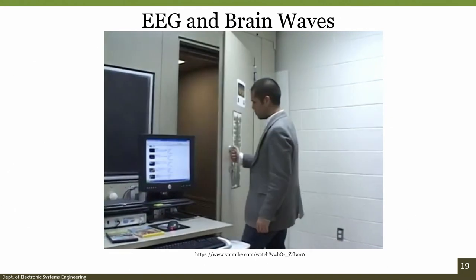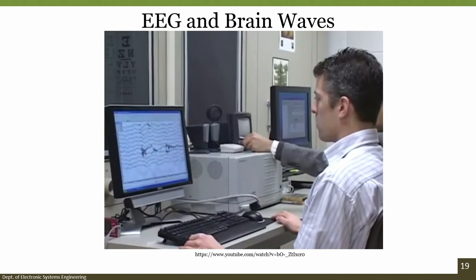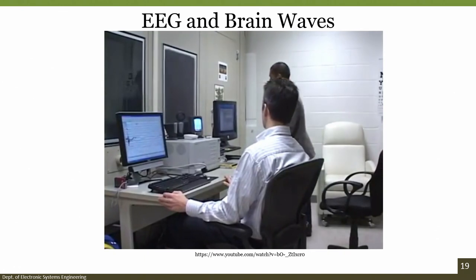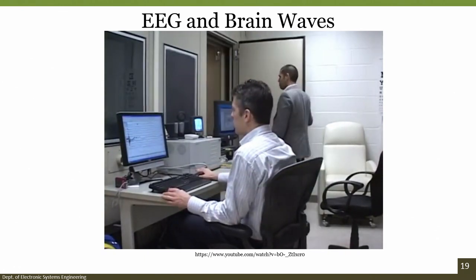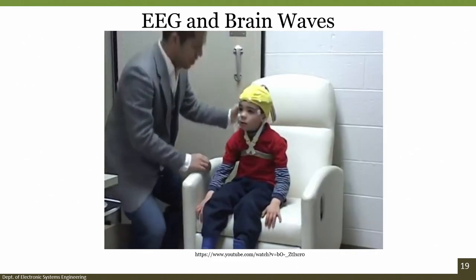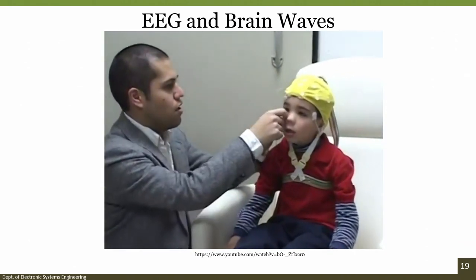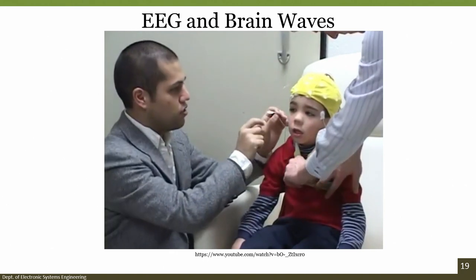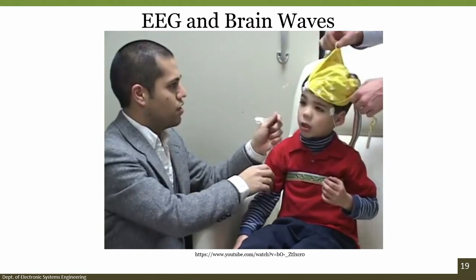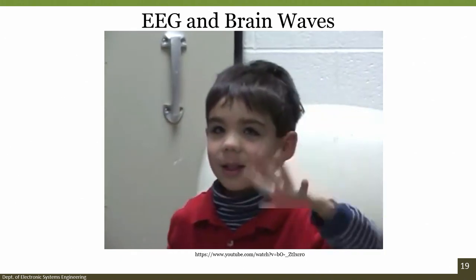Inside the study chamber, it's dark and quiet, and you'll get to watch another cartoon. While you're watching this cartoon, it's important to be very still and very quiet. After you're done watching the cartoon, the cap and stickers will be taken off. They took the cap and stickers off and told him what a great job he did.